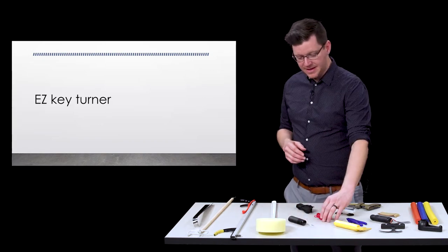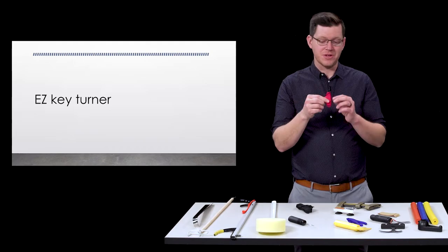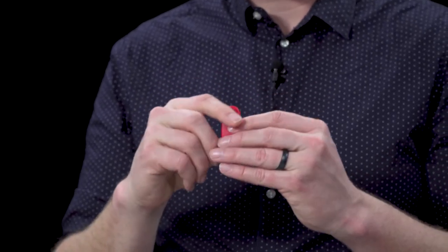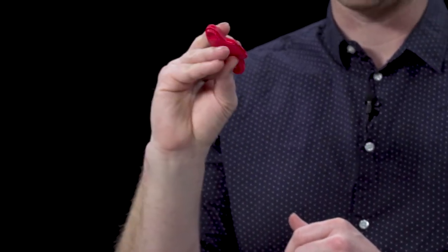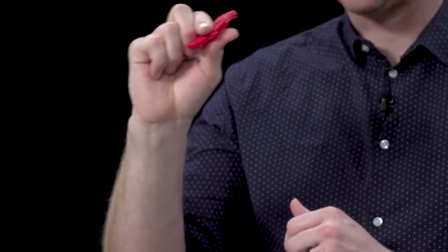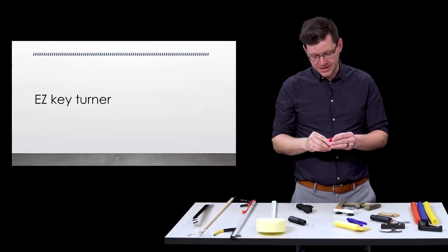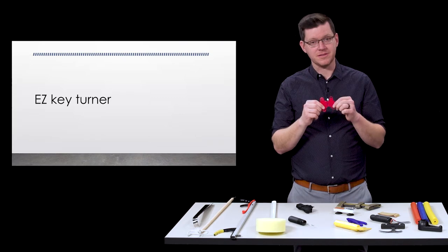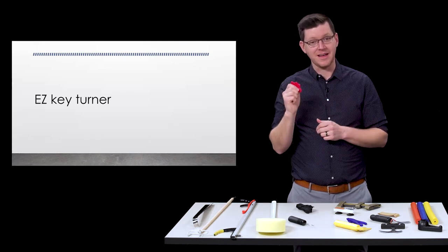Along with that, things like the easy key turner. This will hook onto any key like especially house keys and allow it to be a little more easier grip that you can turn it without having to have really strong pinch strength. You just insert your key into the little slot here and it makes your key a lot easier to hold.